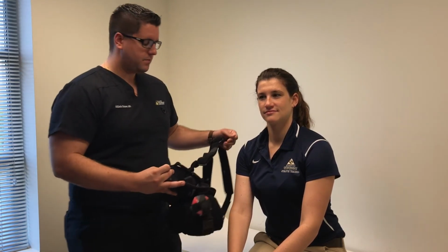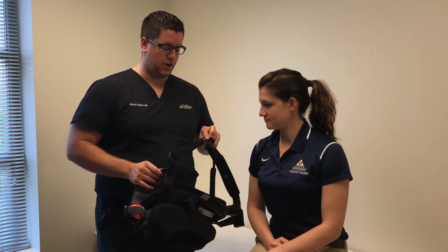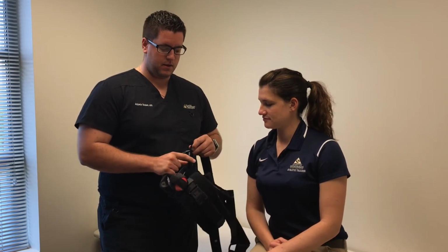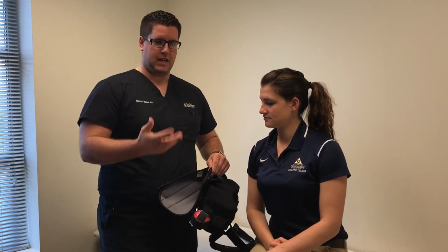So first, always understand that these are the only two clips that you should be undoing. Those are located on strap A, and they're just easily unclippable. And once you have those unclipped, you then place the bad arm in the sling. And you should keep that in mind too.